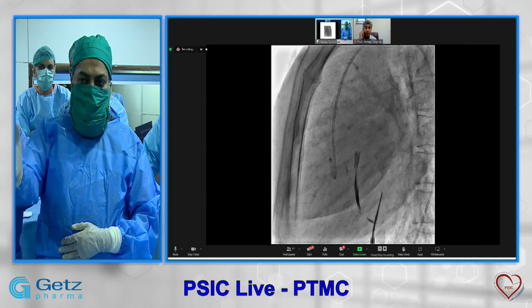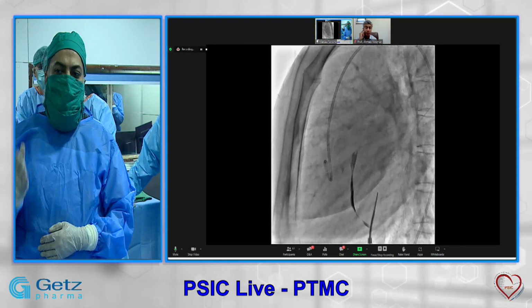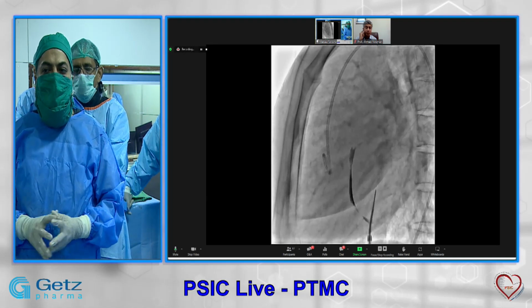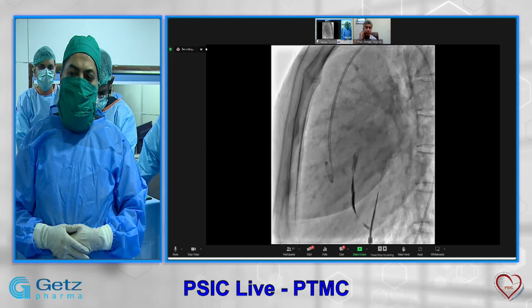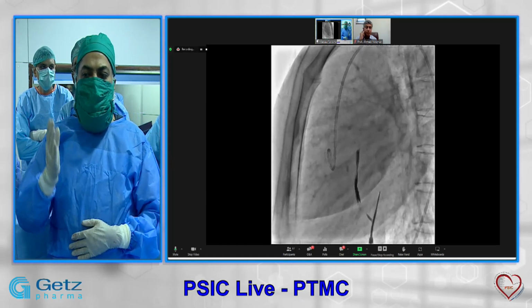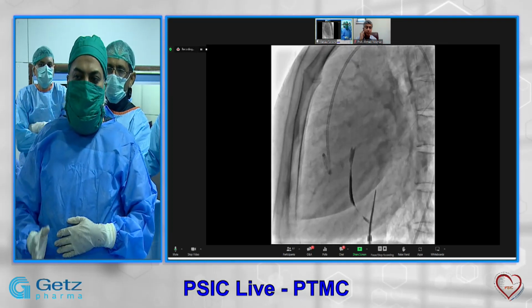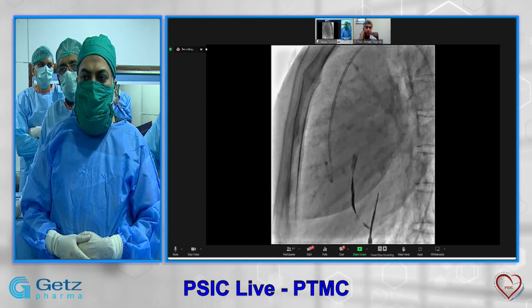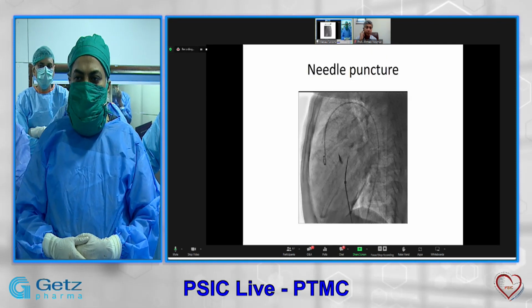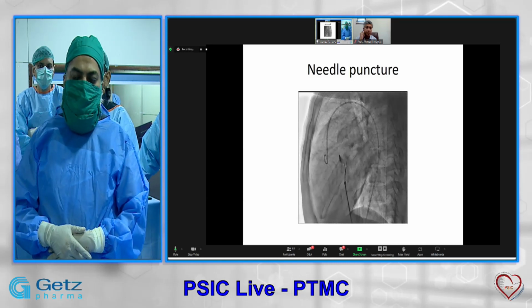Now, we have already seen that if you have punctured into the vertical part, you may dissect the septum. Usually, it does not cause any complication. It's usually self-healing. You don't need to be afraid of it. But if you have gone into the vertical septum, you can bring it down, take the needle again, redirect your needle, and puncture the horizontal part. Next, please. Next, please. Yes.